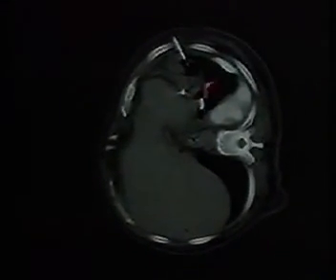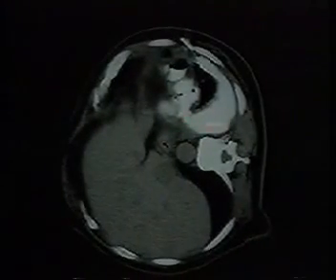What we did in this situation is, with the patient in the decubitus position, we used a trocar catheter to place into the subpulmonic collection. You can see the catheter here with its pigtail tip in this fluid collection. And we injected contrast here, which showed that this was obviously a very complex-looking fluid collection, multiple septations, number of air fluid levels, and you can see, although this is directly contiguous to this collection, it does not directly communicate with the more posterior collection.